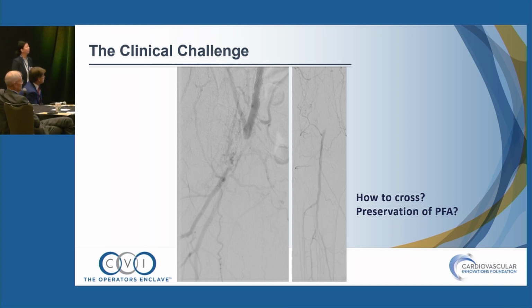It's a hard area to sterilize, and redo surgical incisions in the groin are really prone to infection. So this is a high-risk case from the surgical side. We don't want to do a redo procedure in a groin in a frail guy who's had a bunch of procedures, so I think you can make an argument that a percutaneous approach is optimal.